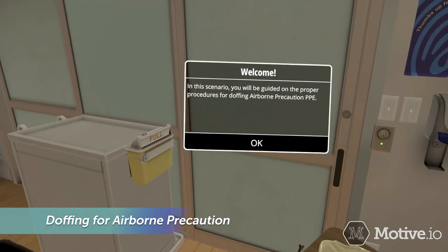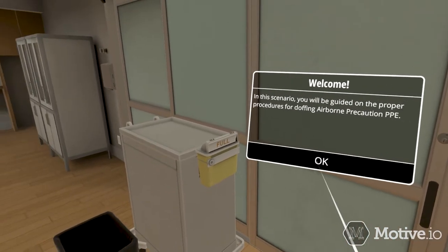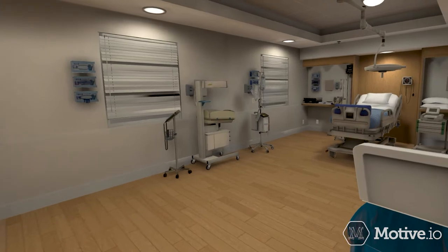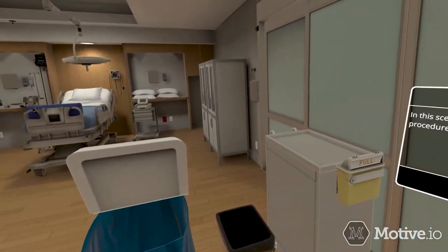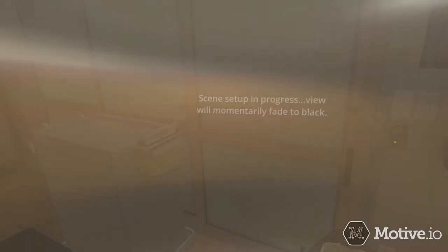In this scenario, you will be guided on the proper procedures for doffing airborne precaution PPE. You have just completed an extubation and are donned in full airborne precaution PPE. Click OK to begin doffing.